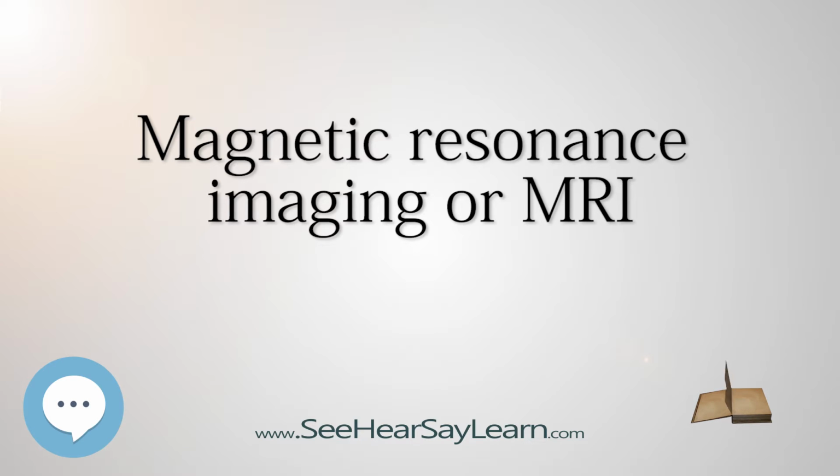Multinuclear imaging holds the potential to chart the distribution of lithium in the human brain, this element finding use as an important drug for those with conditions such as bipolar disorder.